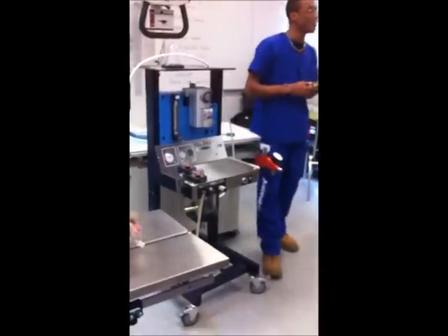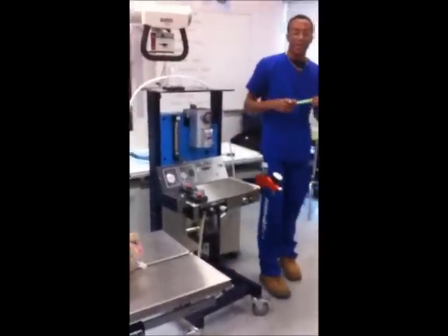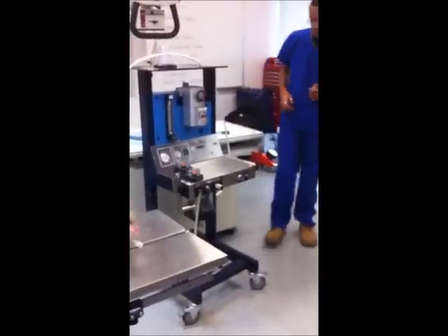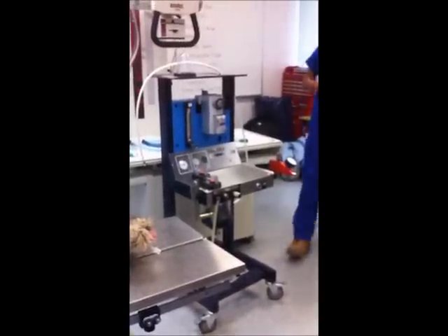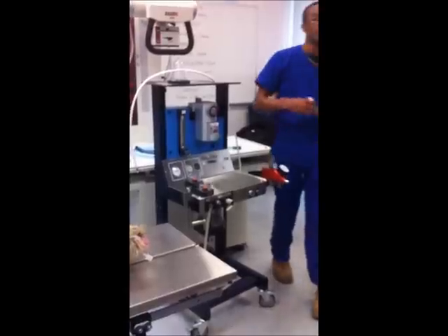Now, we're going to get a nice little volunteer for us. We're going to set up either one of these machines, but let me just touch bases on something first. How do you know whether to use the rebreathing or non-rebreathing system? The weight of the animal.